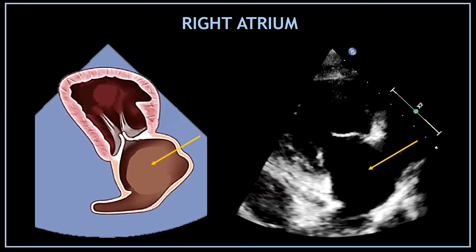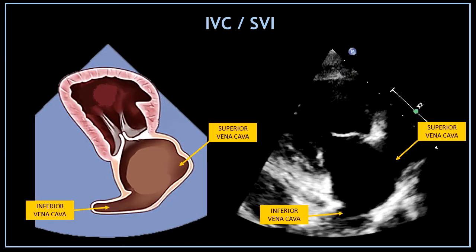The next big echo-free space under the tricuspid valve corresponds to the right atrium. At the bottom of the screen you can see two lines entering the right atrium on each side. The small black line on the left corresponds to the inferior vena cava, and the one on the right hand side corresponds to the superior vena cava.